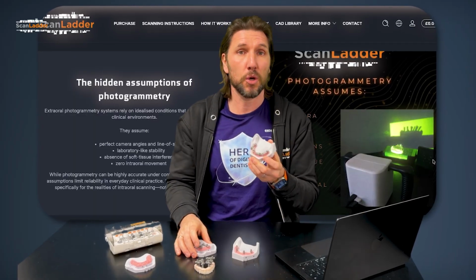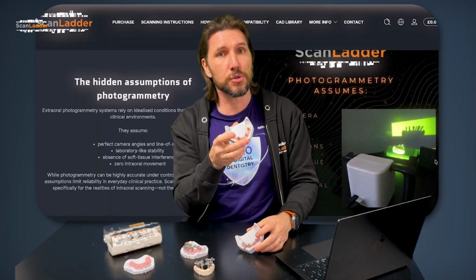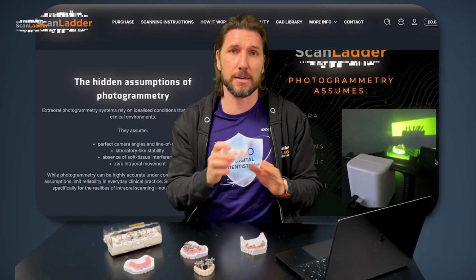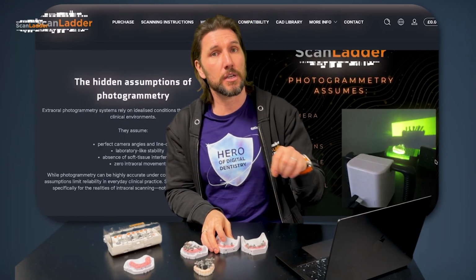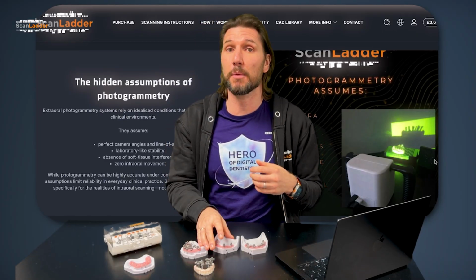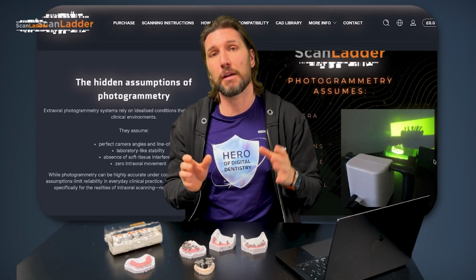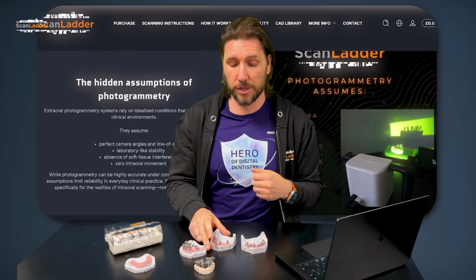Say in example, we couldn't use the central location, and then scan with the tissue sync later at any time. After surgery, when the surgery is finished, we close up the soft tissue, suture, then we scan with the tissue sync, or even 6 months down the line when everything's healed, scan again with these in place.